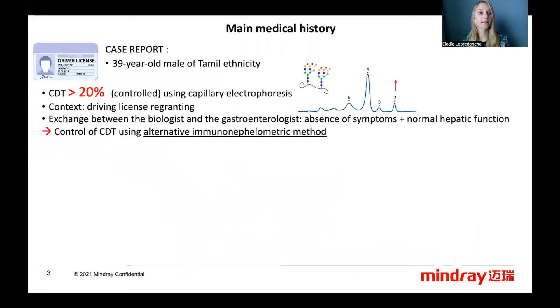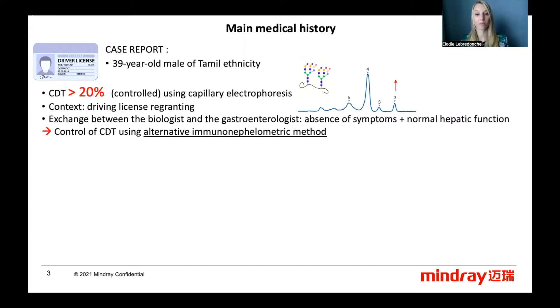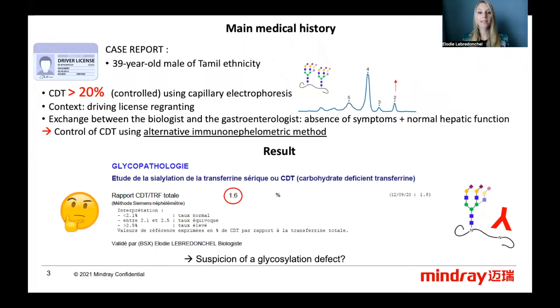We report the case of a 39-year-old male of Tamil ethnicity. A CDT value over 20% using capillary electrophoresis was measured in the context of a driving license re-grant. An exchange between the biologist and the gastroenterologist revealed the absence of symptoms and a normal hepatic function, so a control of CDT using an alternative immunonephelometric method was decided. Surprisingly, the value was this time normal, under 2% with this method in our laboratory, and it was controlled twice.